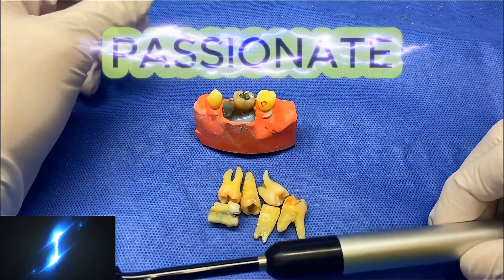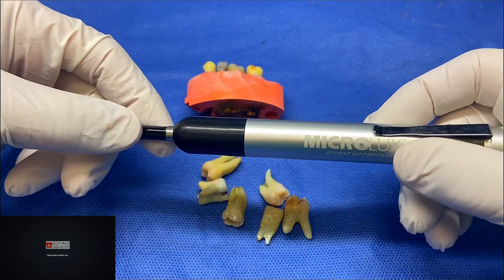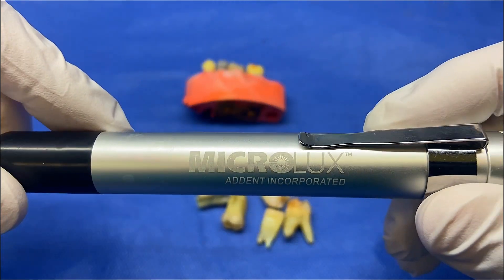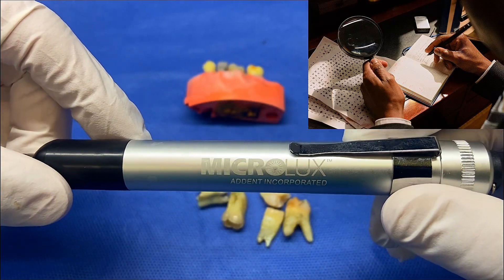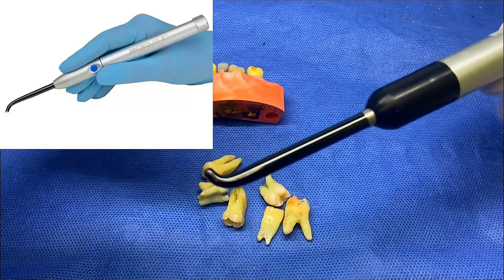Hey, Ash here from All Things Dentistry, the place where we're passionate about sharing those unwritten hints and tips in dentistry. If you haven't used a transillumination — I just found this literally somewhere in the building and it's called a MicroLux. I looked online, there's a MicroLux 2, the updated model.